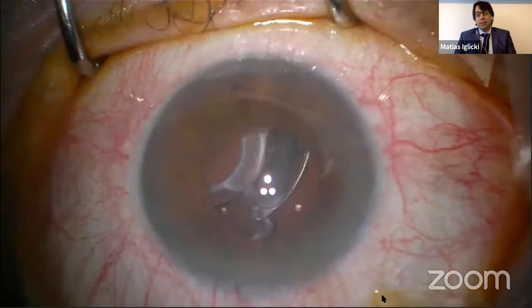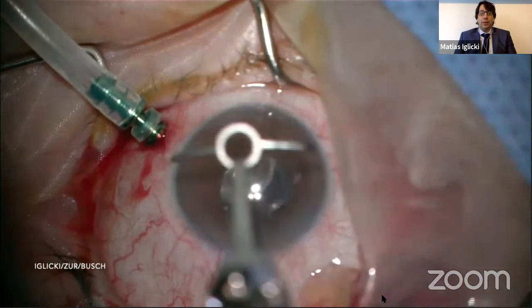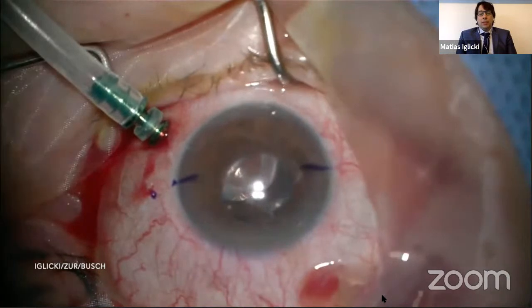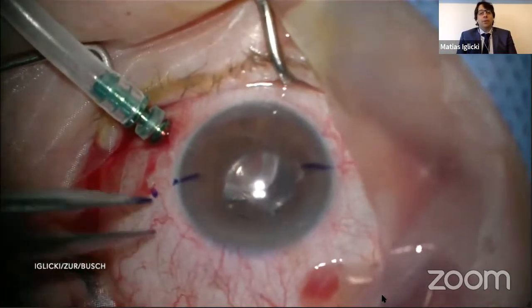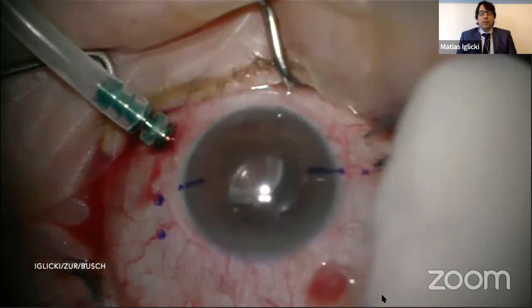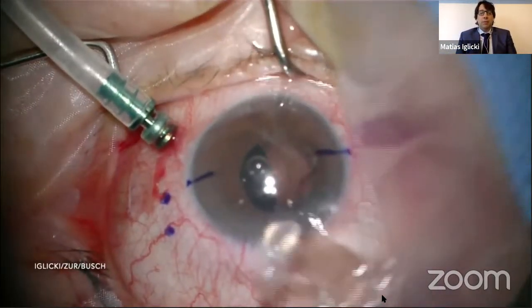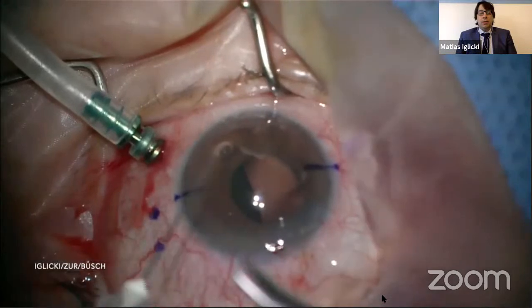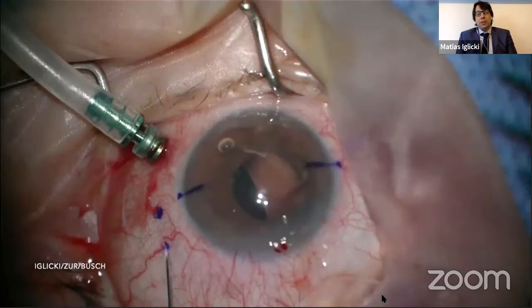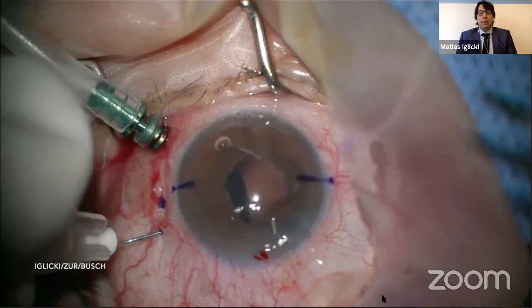So, wrapping up the case, this is the case we performed last week. As you might see the whole technique, nowadays we mark 2 millimeters from the limbus. I saw one question as well that was asking about this. 2 millimeters in this case of a diabetic patient. As you might see, there is not good dilatation. The iris is compromised. And you might see this is an ultrathin wall needle. We bent it at a 40 degree angle. We inserted it. We created a tunnel. As you might see there, it should be vented.